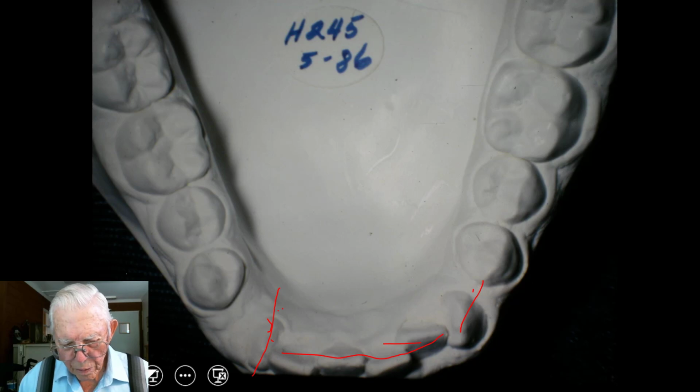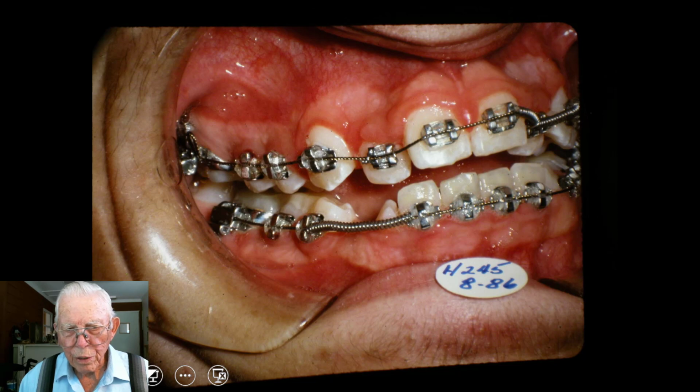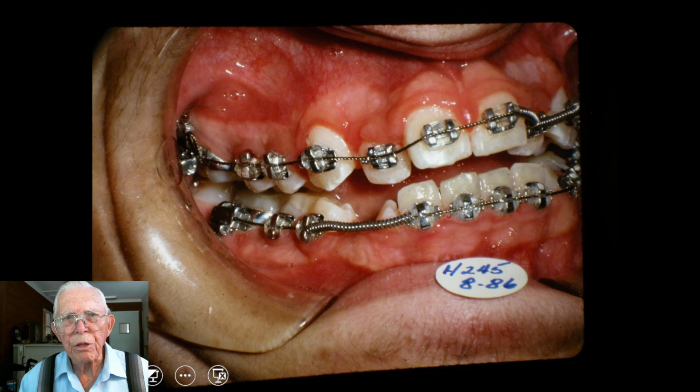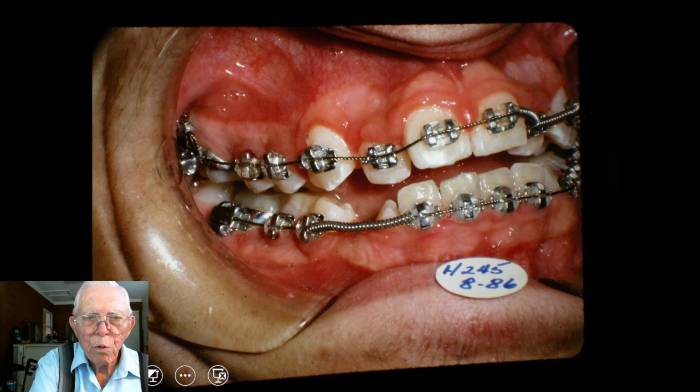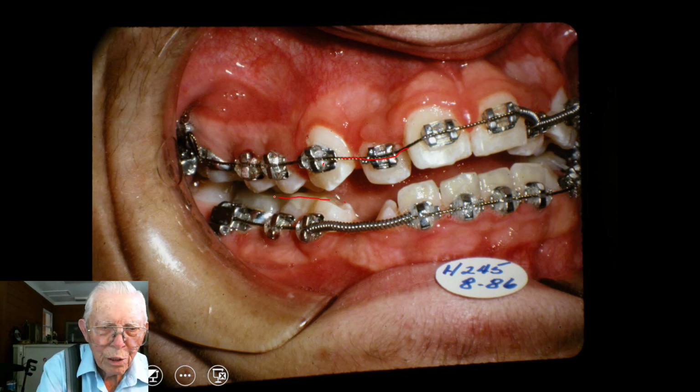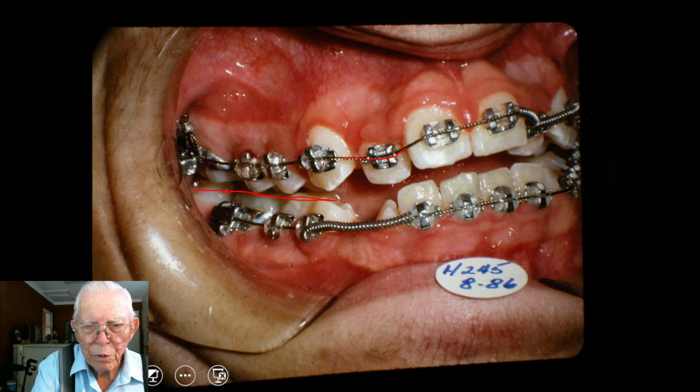Now, okay, we start this. I'm not going to show everything about the case, but most of it's just simple, regular orthodontic things that we need to do. So we would want to put in a flexible wire here with some expansion in it, and then this wire goes in and catches that tooth, and we've bonded these little thin blocks on top of your teeth.